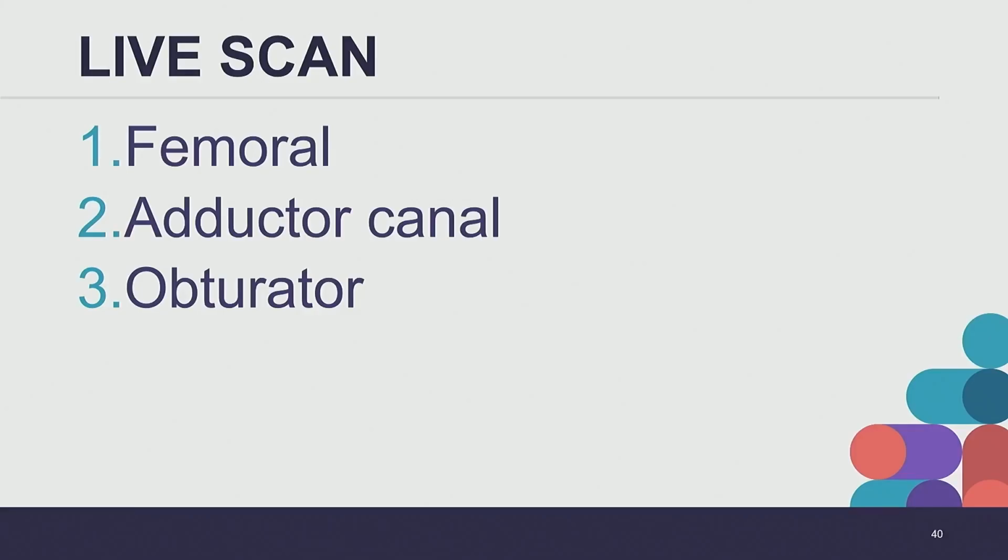All right, so bone is always going to be easy to find, right? So we see femur there, and we can move medially until we start to see the sartorius. You can see that the femoral vessel is just under. And as we track up, the relationship between the sartorius and the femoral artery changes, because remember the sartorius is moving from the lateral aspect up at the ASIS to the medial aspect at the medial patella. So in terms of where I would block, I generally go more or less where we're in the belly of the muscle.